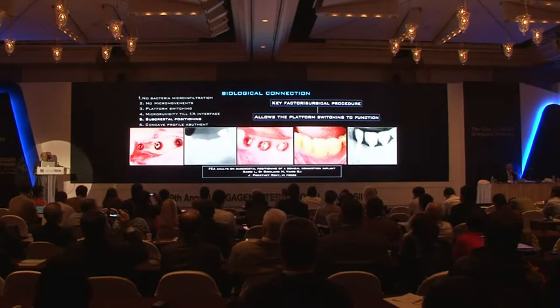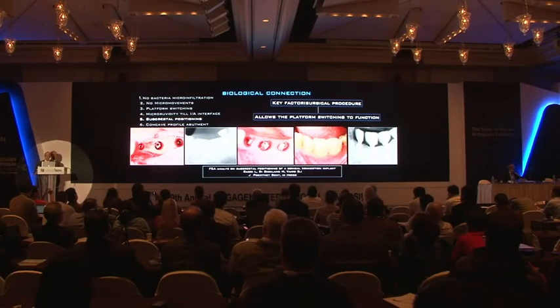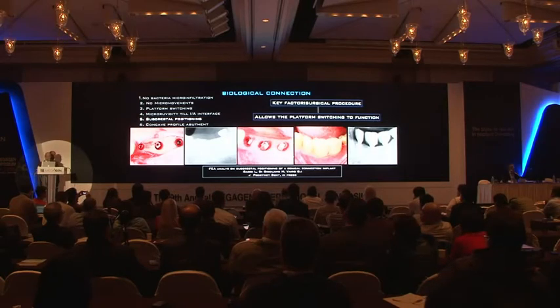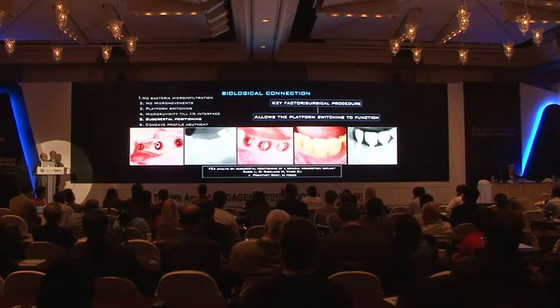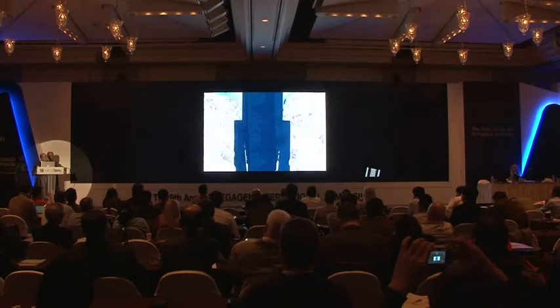In an in-press research that we performed, we studied the performance of different subcrestal positioning of implants with a conical connection. The results are that 2 millimeters subcrestal is probably the best compromise in terms of biomechanics. Here you can see different positioning under the bone.